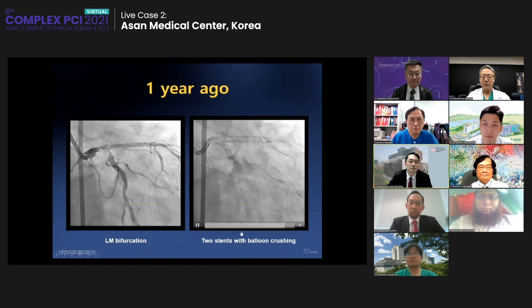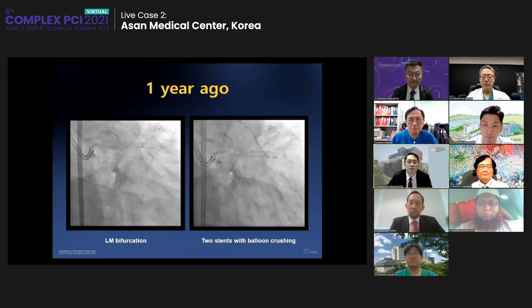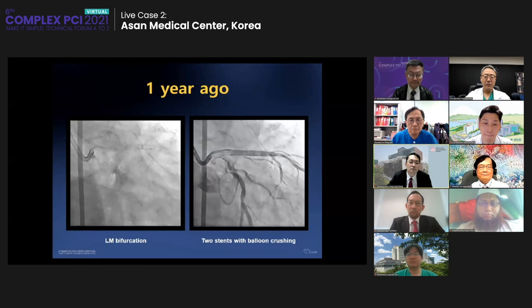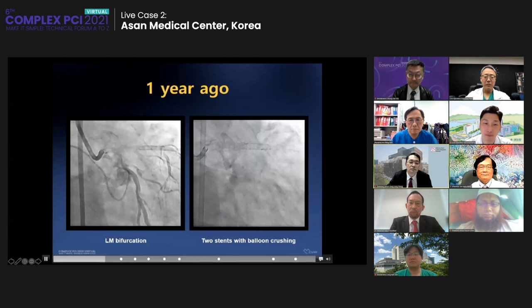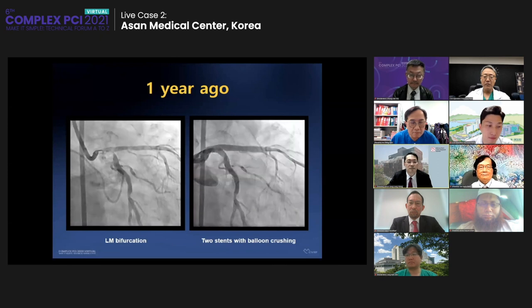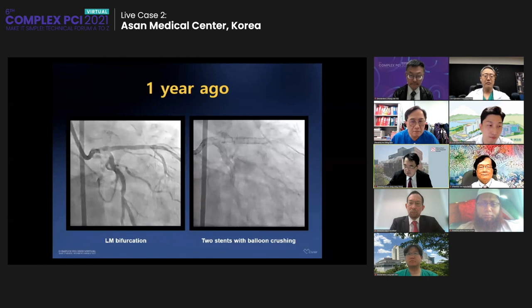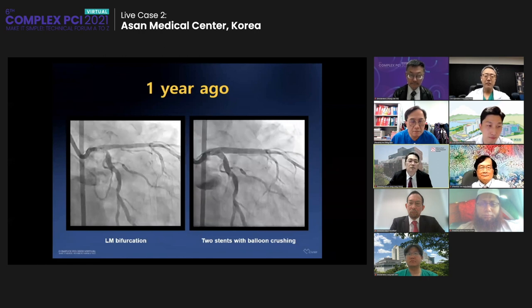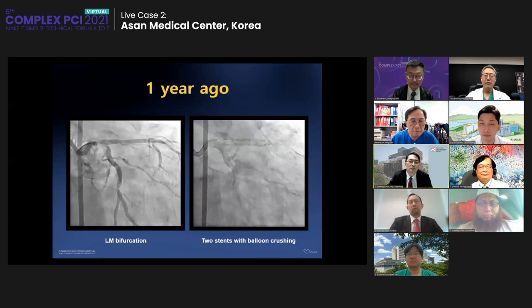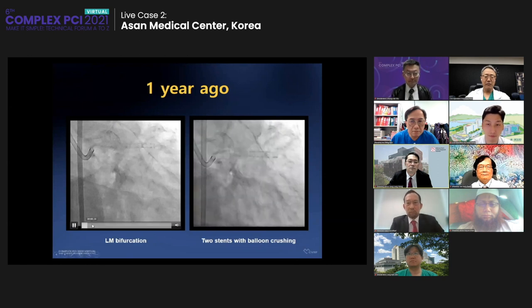All right. Let's look at the loosened areas, the proximal circumflex areas, and so we got some idea. What was it? Do you have any idea about that? We checked the IVUS during the first procedure, so we know what is in the circumflex. The heaviness was mainly calcium, very eccentric calcium. It looks like a calcium nodule. Let me check the IVUS from the previous procedure. Okay, IVUS please.